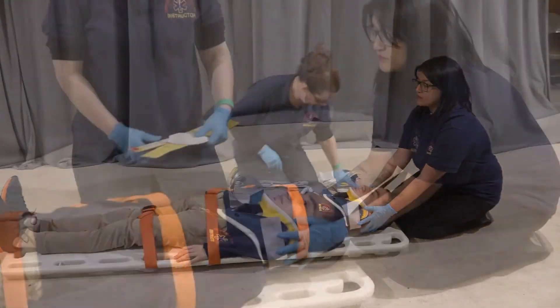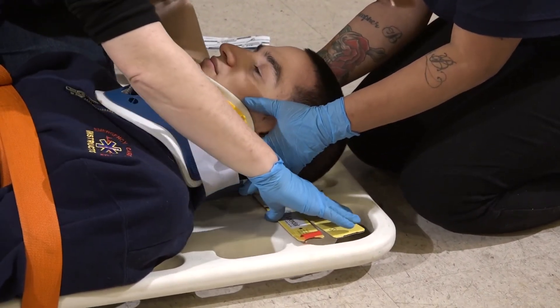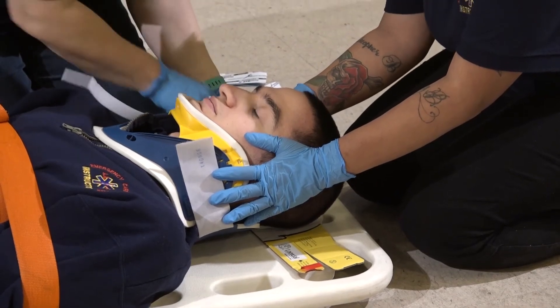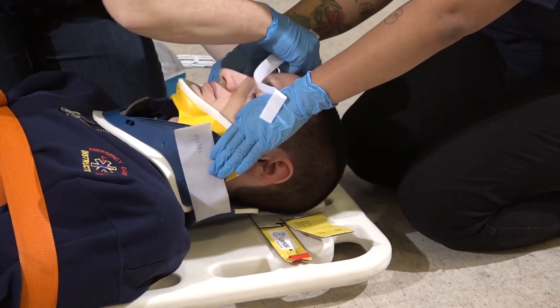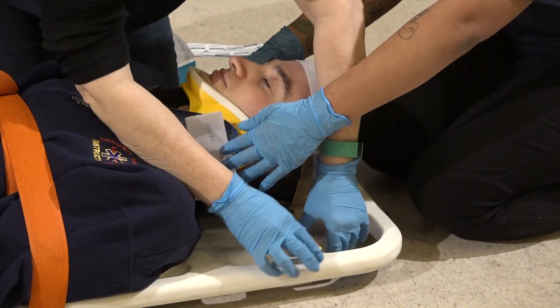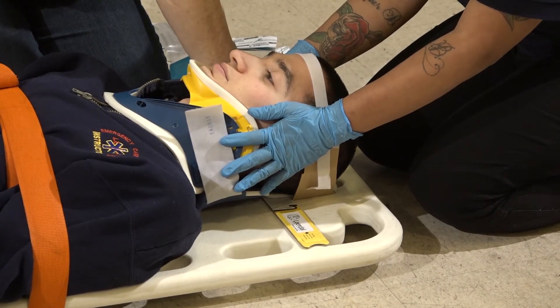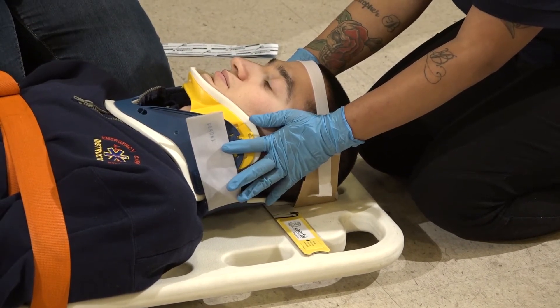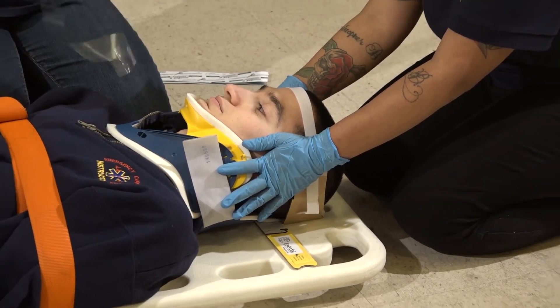Now I need to secure the head. We're moving in through the voids in the lower neck and then slowly sliding it up so that the patient's head is resting on it. I'm going to take my Velcro strap and secure the head, pull the tabs so that the head is secured. Last but not least, I'm going to take my head strap and immobilize the head to the board.